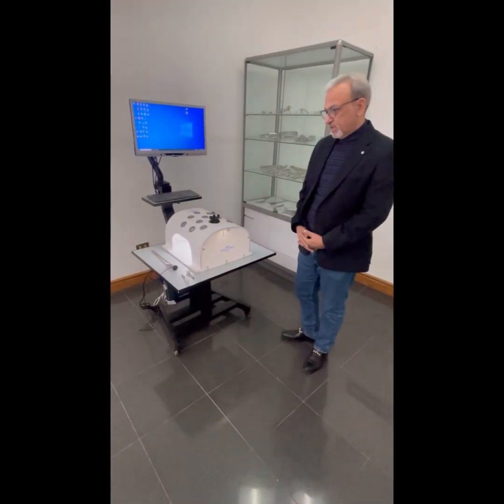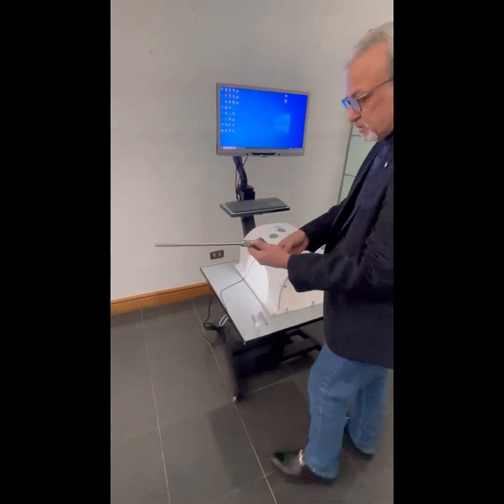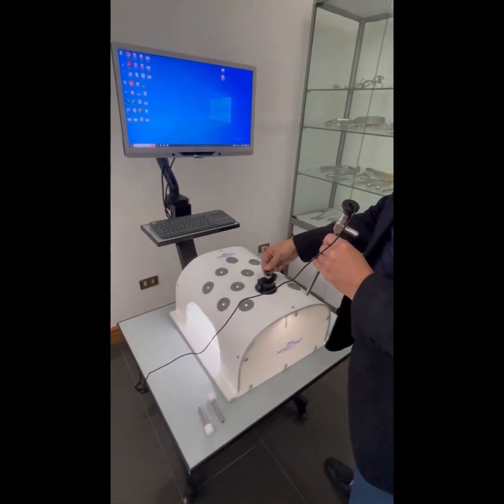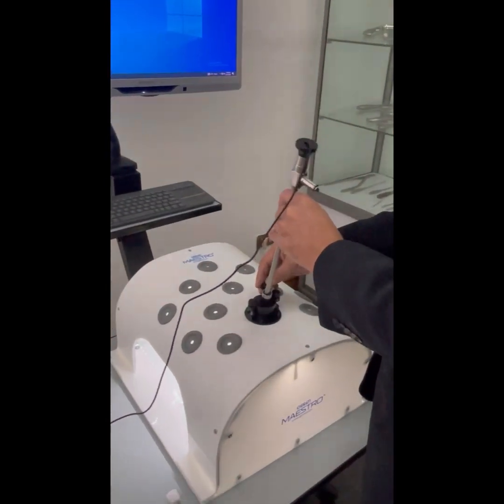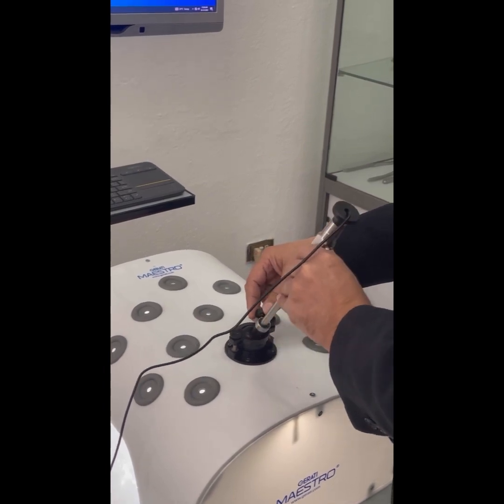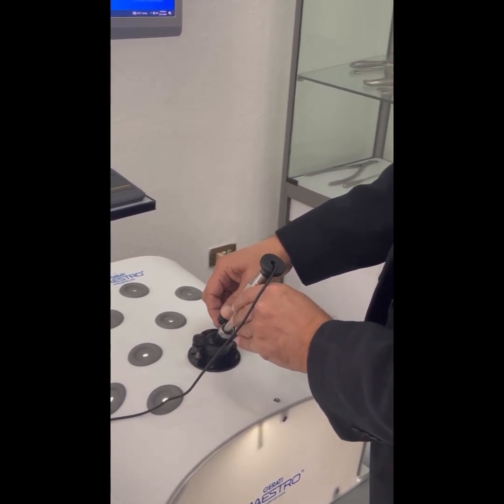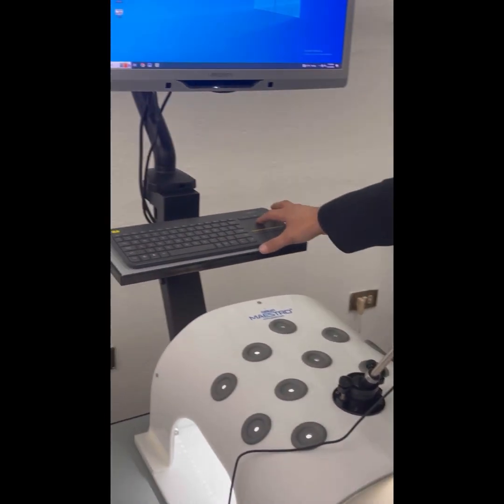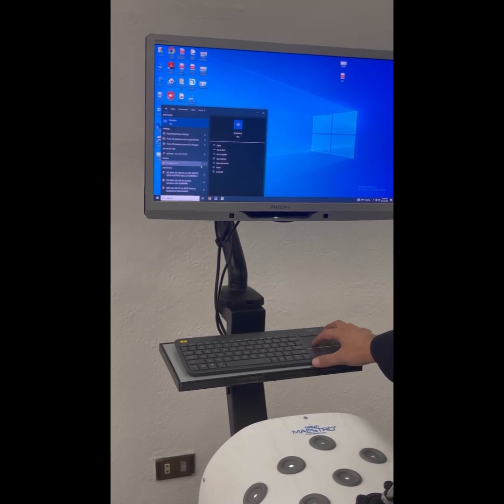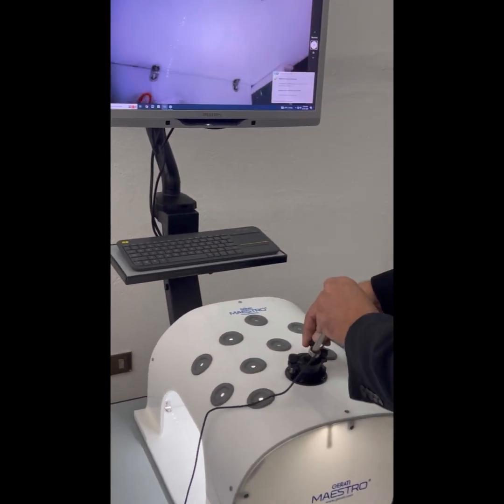Now we will explain how these components are fitted into the laparoscopic trainer and how it is used. The USB of the laparoscopic camera is attached to the CPU, the camera tightening screw is loosened, and the camera is inserted. The camera position is adjusted and fixed using the tightening screw. Then on the computer, you open the camera app, which is built into Windows 10, and the camera feed is shown on the monitor.